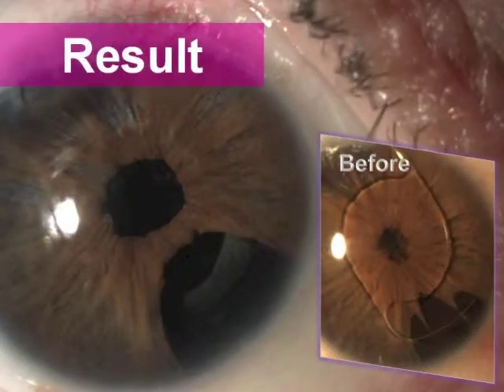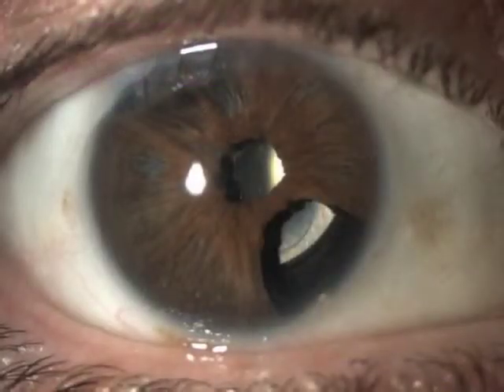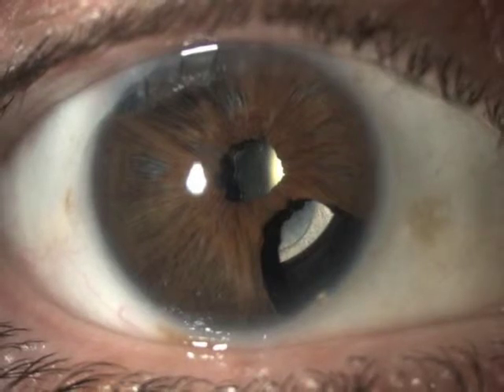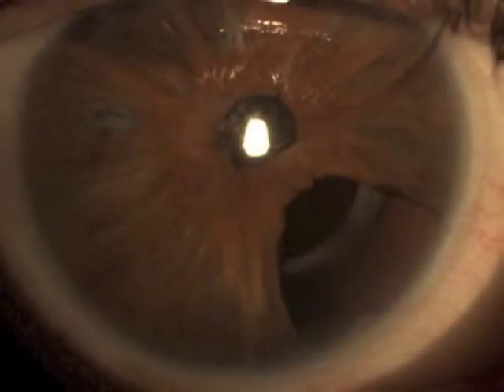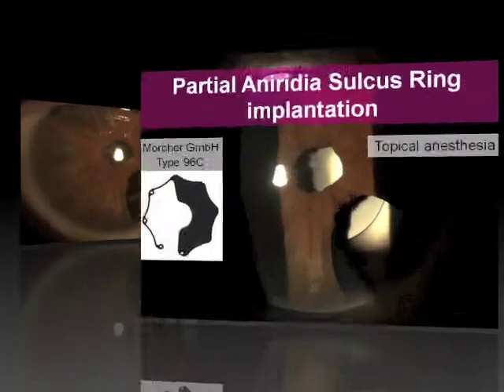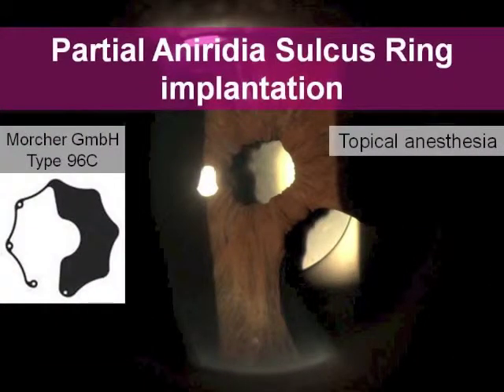Vision recovery was perfect, 20/20, but the patient complains of monocular diplopia and glare due to the inferior iris defect. We tried to adapt a cosmetic contact lens, waiting for patient adaptation, but the symptoms did not change. 10 months later, we solved these symptoms by implanting a partial aniridia sulcus ring.